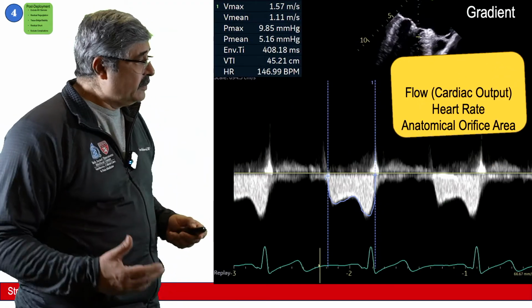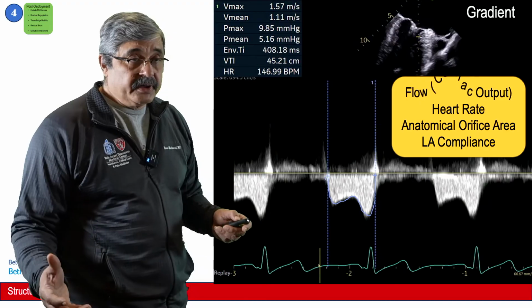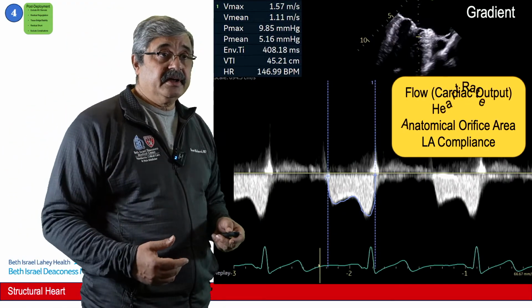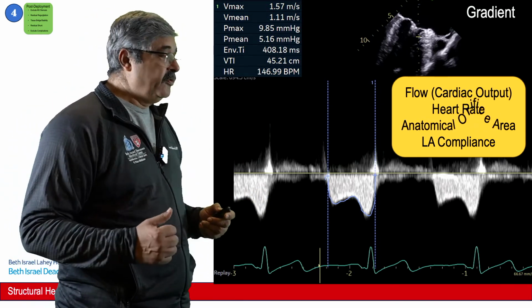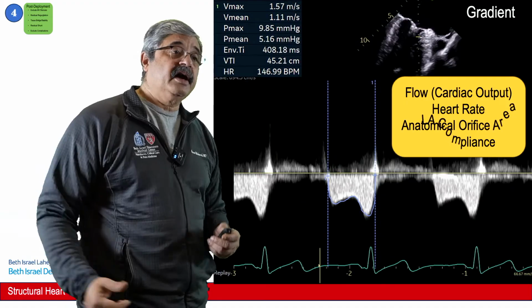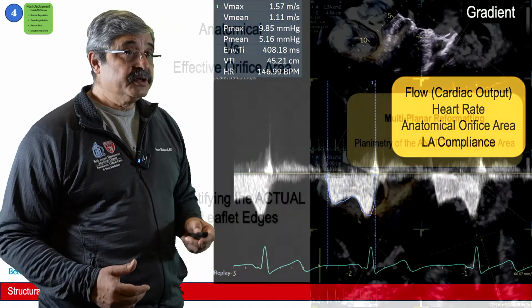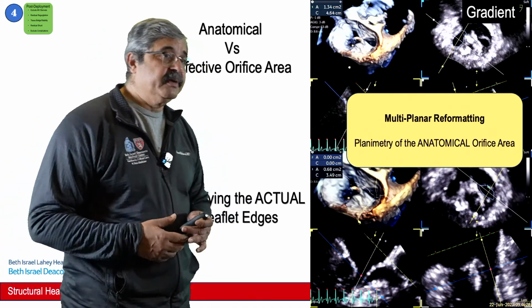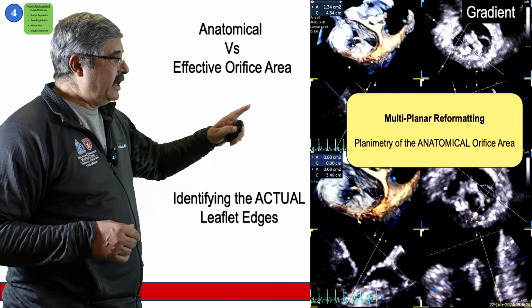However, gradients are pretty complicated, and they are a product of the cardiac output of that state, the heart rate, the anatomical orifice area, the left atrial compliance. So all these things have to be factored in before we call that this gradient is prohibitively high and we cannot accept this and we move on and do something. One of the most important things that we do is called planimetry, that is using a three-dimensional echo to get both valve orifices and actually planimeter both areas.